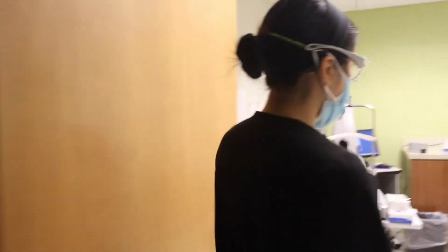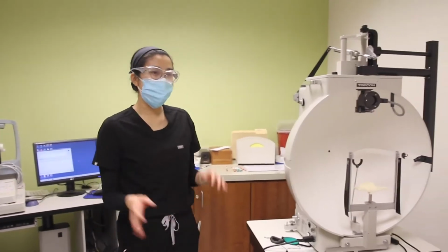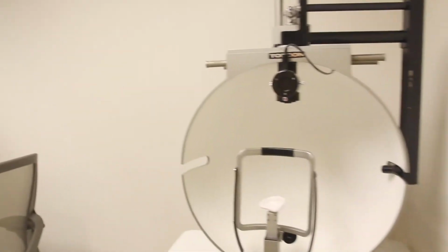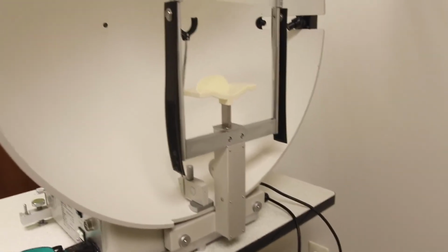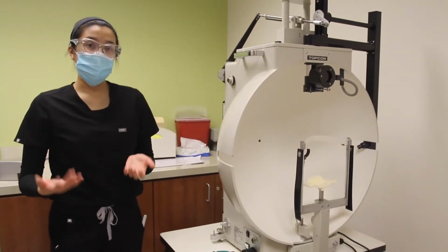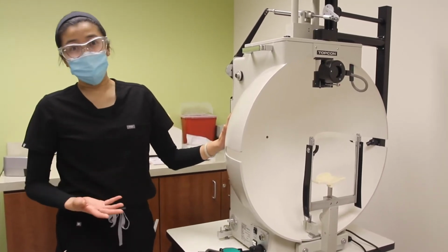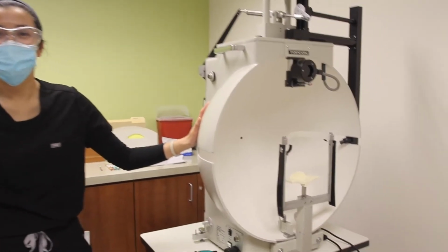And so I'm going to bring you into this other room that's within our testing suite. This room specifically holds 2 Goldmann visual fields, one over here and one on that side as well. The Goldmann visual fields are a great tool because you can use them to determine if there are other, more peripheral visual field defects potentially. The Neuro-Ophthalmic Disease Service and the Low Vision Service use this tool quite frequently. As a resident in the Neuro-Ophthalmic Disease residency, you learn how to use this Goldmann visual field bowl within your first couple of months here, which is excellent because it's a tool you can use in the future as well. So we just wanted to show this to you.